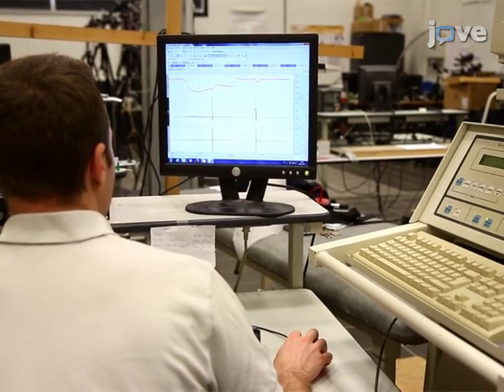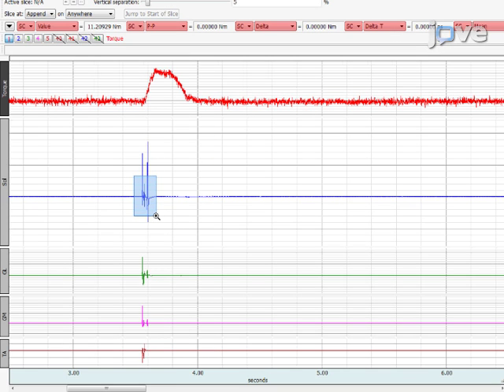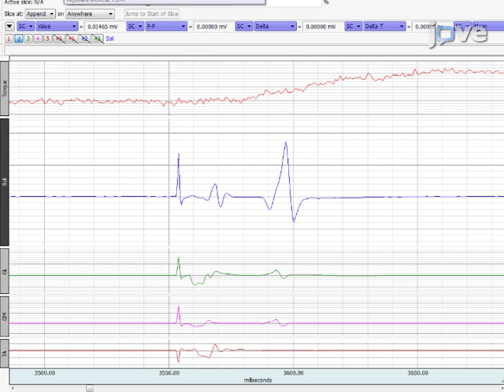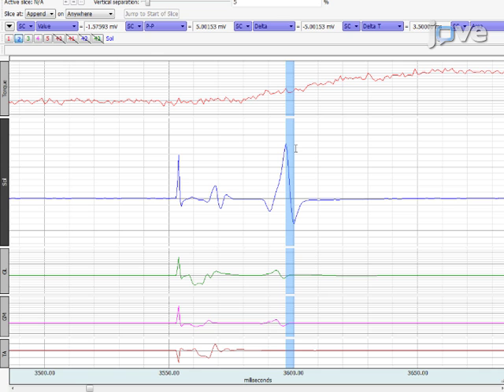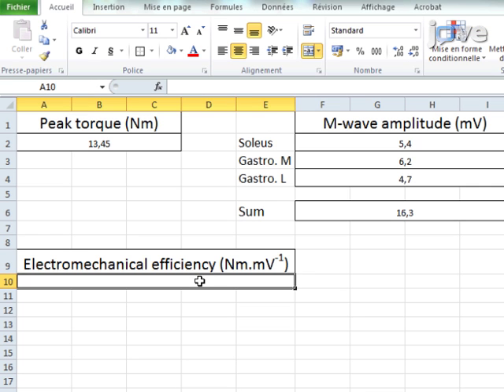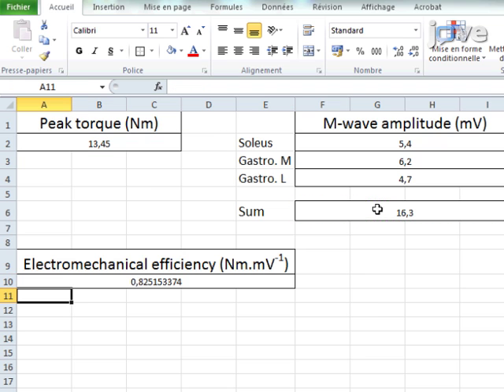Using software such as Acknowledge 4.1, select a time window including the EMG response associated with the twitch at rest. Select the H-wave or the M-wave and measure the peak-to-peak amplitude, the peak-to-peak duration, and the area of the waves. Then select the resting twitch and measure its peak torque. Calculate the ratio between the peak torque and the sum of the amplitudes of the soleus and gastrocnemii M-waves to quantify the electromechanical efficiency. This ratio reflects the efficiency of the excitation-contraction coupling.